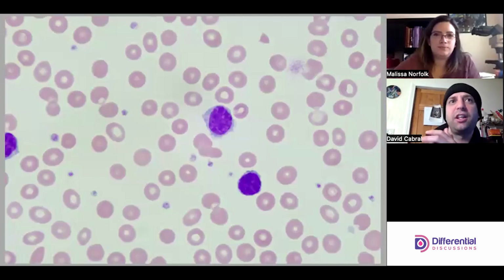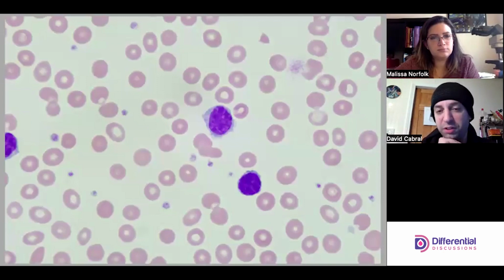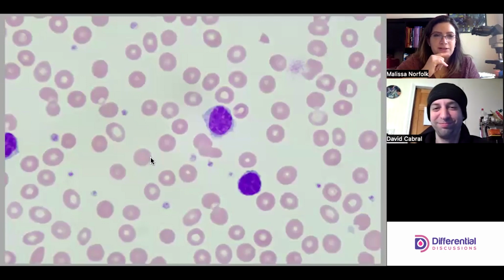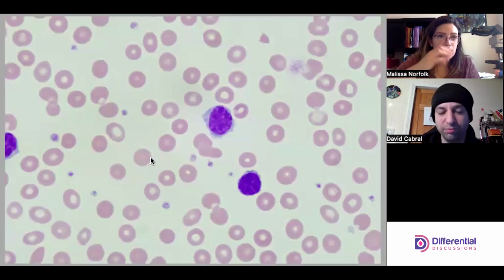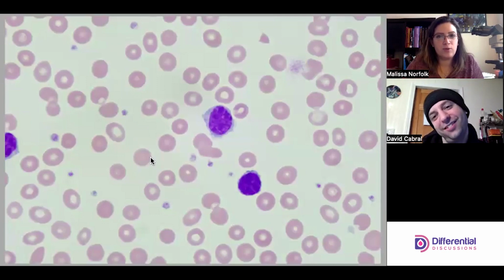We don't really look at cytoplasm for identification very much. In practice, we usually use the nucleus and chromatin patterns a lot, but we'll be focusing exclusively on the cytoplasm. We purposely stopped on this field because it varies by patient, but a lot of hairy cell patients have a low percentage in the peripheral blood. Once we look at this one, we might scroll around and never see another hairy cell. Yeah, it's totally possible. That's why I wanted to stop on it and point it out.